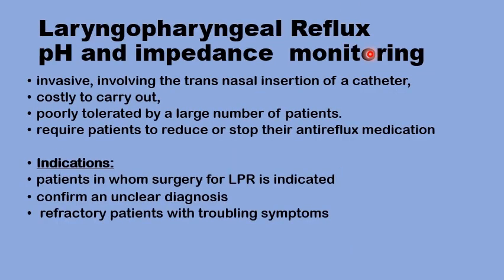And finally, laryngopharyngeal pH and impedance monitoring is an invasive technique involving transnasal insertion of a catheter. It's also costly to carry out, and it's poorly tolerated by a large number of patients and entails that the patient reduce or even stop their anti-reflux medications for a week before the test.